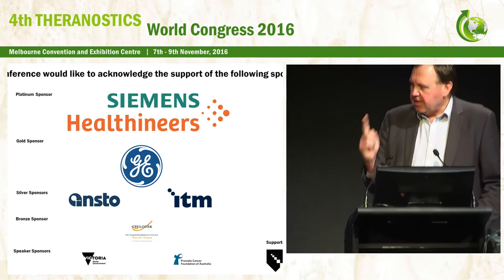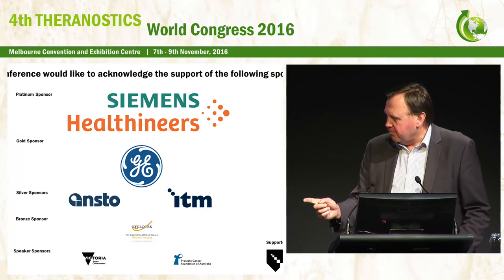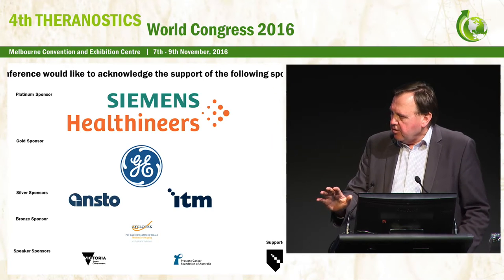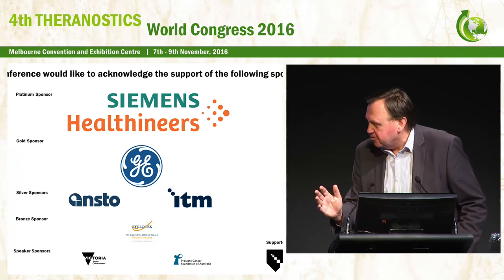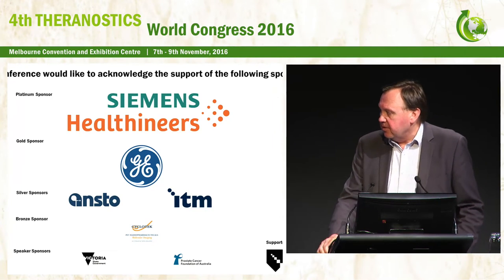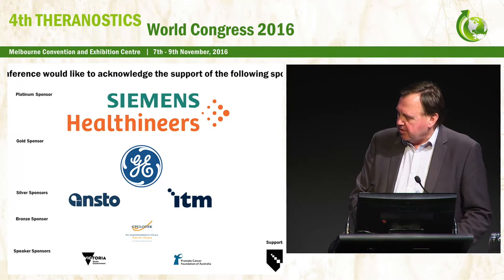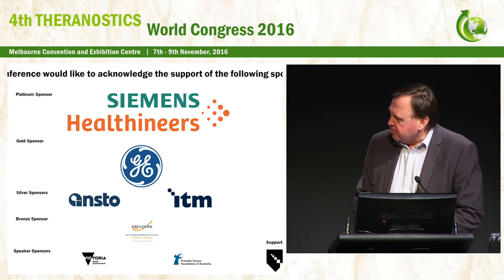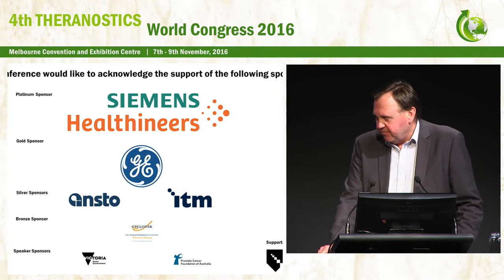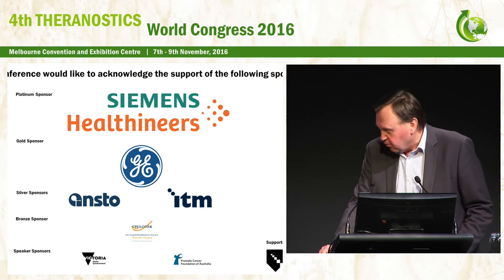So if you've got a PET tracer that's got a long enough half-life, then you would do it with PET. I'm sure. But we don't often have that. And also, if you think about SIRT planning, you don't do it just to do the dosimetry. In fact, you don't do it to do the dosimetry. You do it to make sure you're not addressing non-target tissues and also to look at the liver-lung shunt fraction. So if you do that, for those reasons, you then get the dosimetry as well. So it's the motivation for doing it. I tend to think with the PRRT, with lutetium, with amino acid infusions and all the other complications, that you just use a standard dose first off. I think that's what we would do anyway.